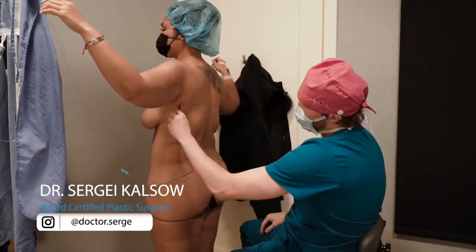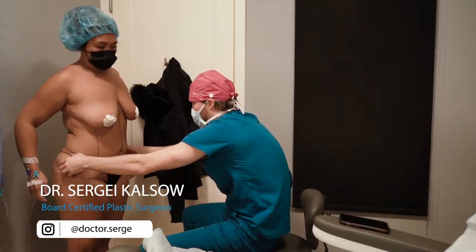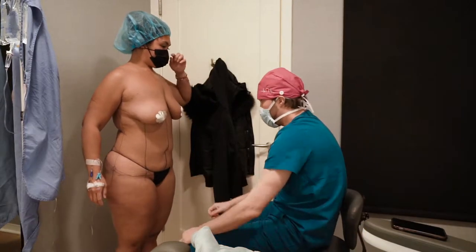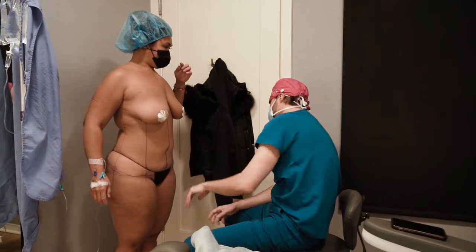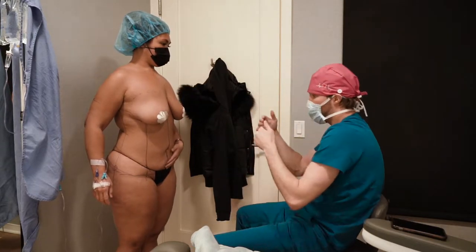We're doing the 360 Air Revision, BBL, arm lipo here. We have these hip rolls here — they're kind of high. So I'm going to shape you out a little bit, make you more hourglass, take those down some, and then etch you a little bit. I'll try to get as much fat as I can and fill you up to give you the projection.